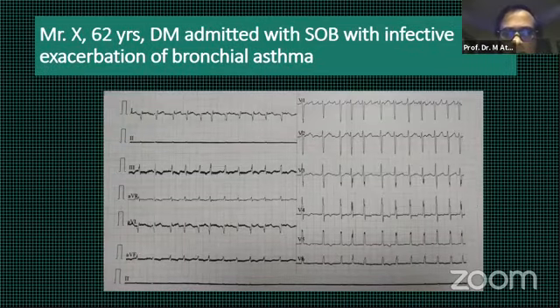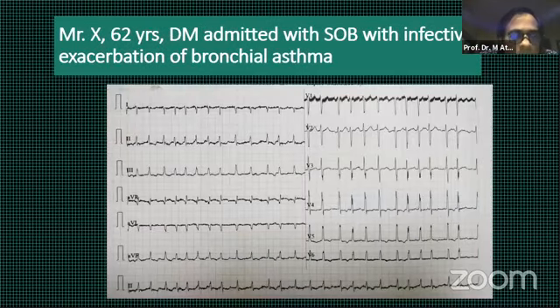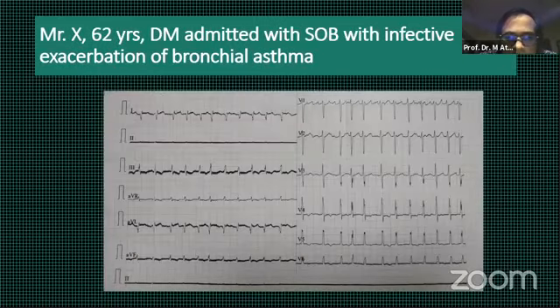Dr. Shofik. Yes. Hello, Dr. Can I ask you a question? Sure, sir. This ECG, in absence of the appropriate P waves, that is in case of atrial flutter or fibrillation like this, when there is no organized correct P wave, how can you exclude the old high lateral MI in this patient?